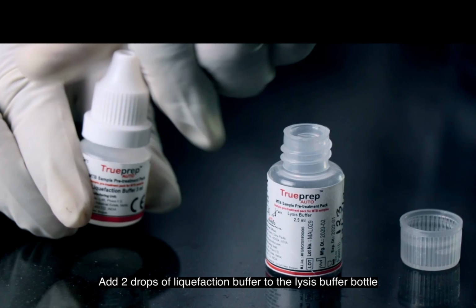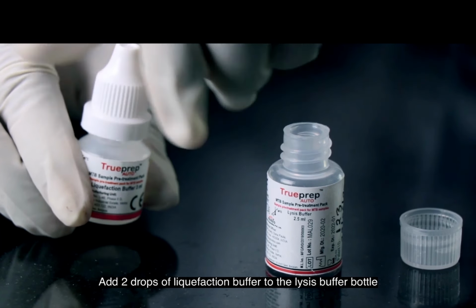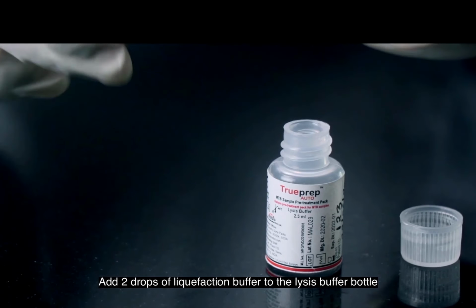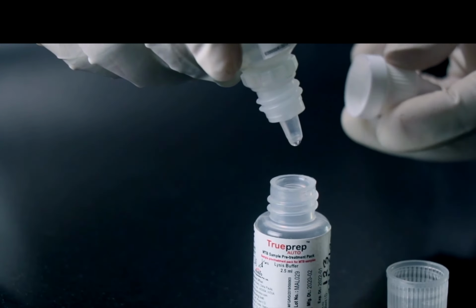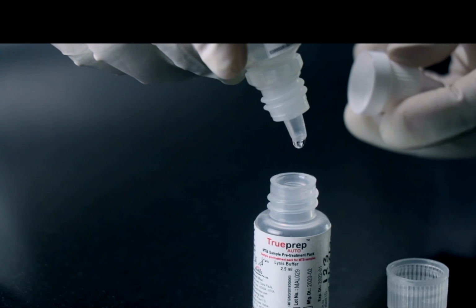So here again you have to use this liquefaction drop. 2 drops you have to put in this particular buffer. Here also you have to be careful that you don't touch the lysis buffer bottle. So at some distance, 2 drops. So total 4 drops. Okay. So first in the sputum cup 2 drops, then here in the lysis buffer 2 drops.